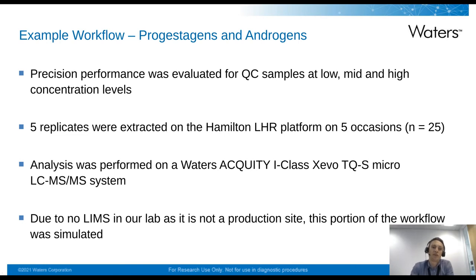And so with my final few slides, I just wanted to go through an example where we have used this workflow to simplify the extraction and analysis of a panel of steroid hormones within our lab. And I think it nicely shows some of the features that I have discussed and also goes through a typical sample extraction method for LC-MS/MS.